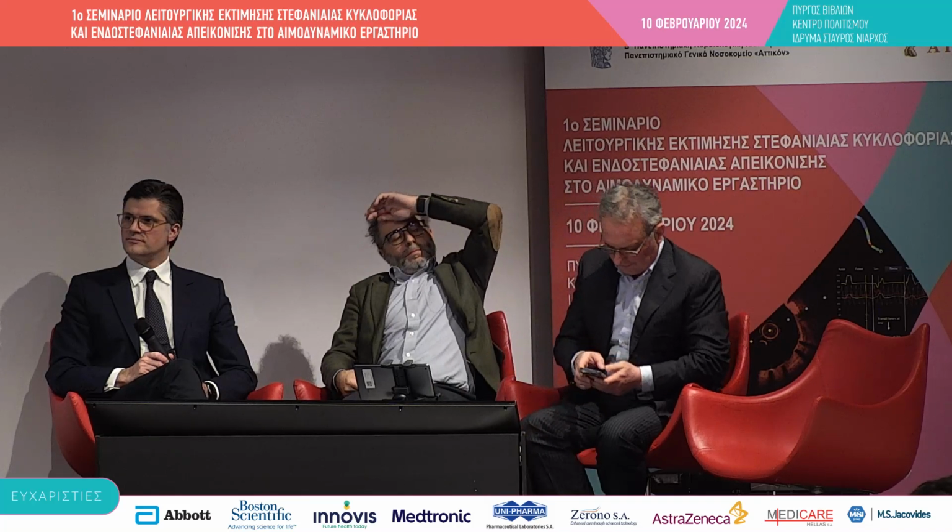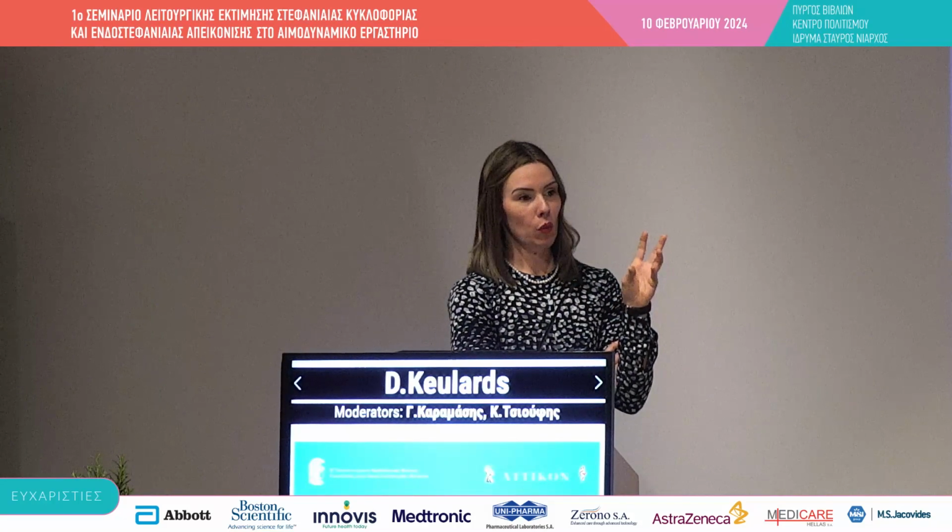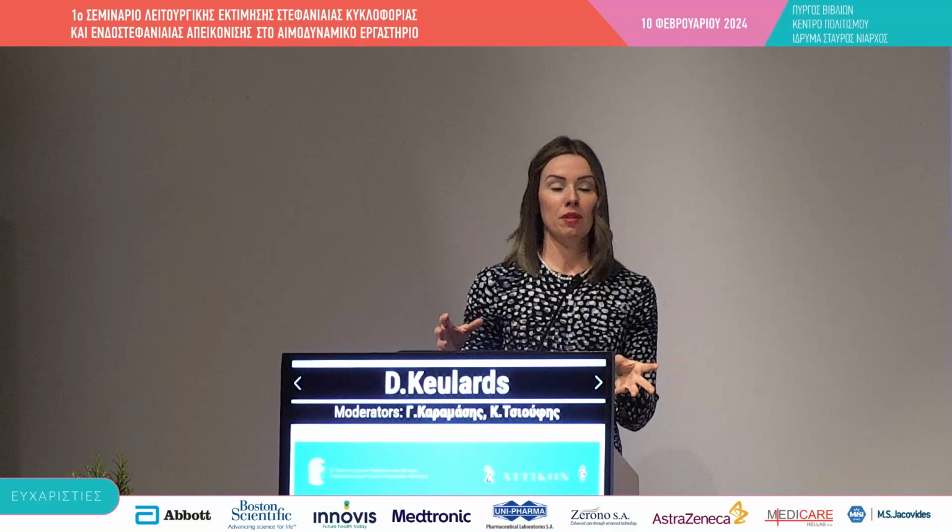Yes, we did perform a study. It's called the ADDED study. It's published in JACC or European Heart Journal, I have to look it up. But we did treat half of the patients with coronary microvascular disease with the calcium antagonist diltiazem at the highest dose, and the other half with a placebo. Then they all came back to our cath lab 6 weeks later to repeat the measurements, and unfortunately there was no difference.